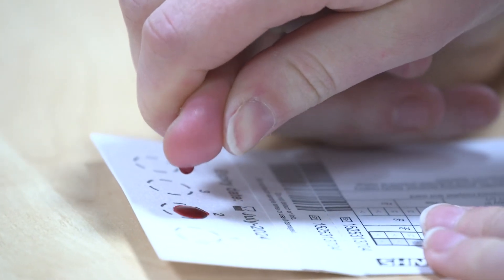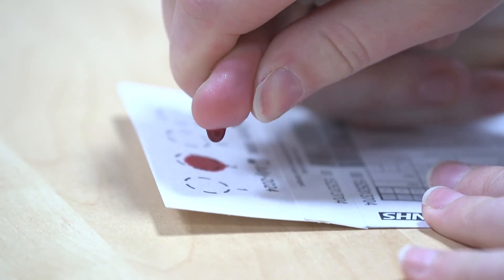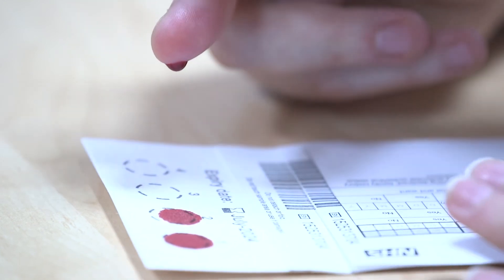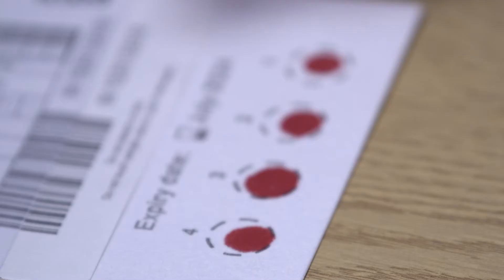Do not press the foot onto the card. Let the blood form into a drop and then let it fall onto the card. Let two drops of blood fall into different circles on the card. If any blood droplets overlap or do not fill the circle, then do another spot. Blood spots should fill the circle but should not be double spotted. Samples are commonly rejected because the spots are too small.